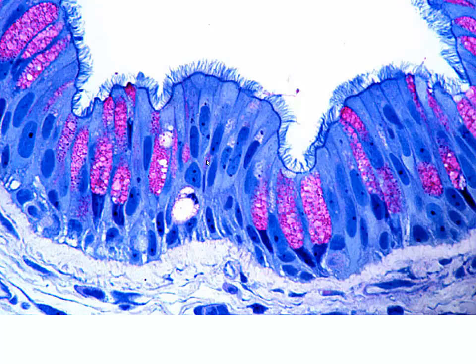This is a really nice view of our very typical pseudostratified columnar ciliated epithelium in the respiratory tract. We can see the pink stain here. These are our mucinogen granules of our goblet cells. We can see our basal regenerative cells. We can see our tall ciliated cells on the surface. You can pretty much guess at this point we are looking at some place in the respiratory system.